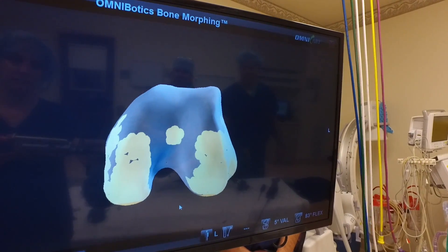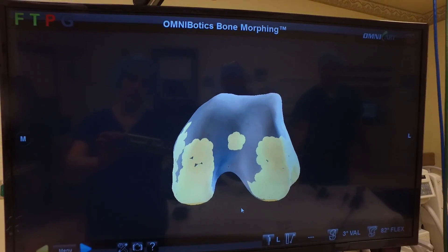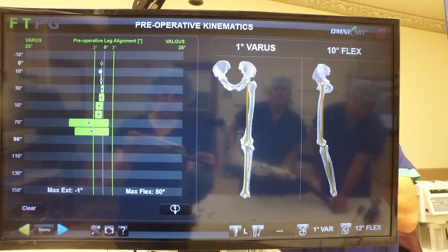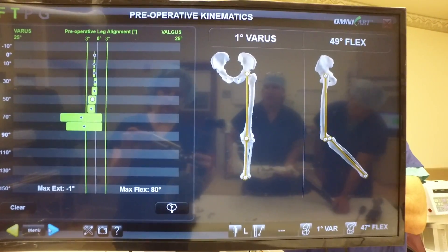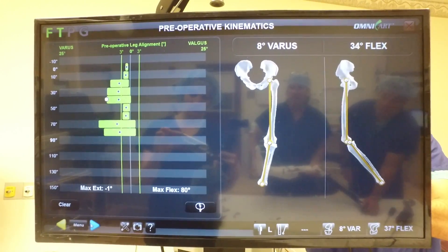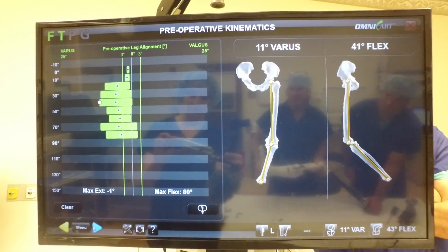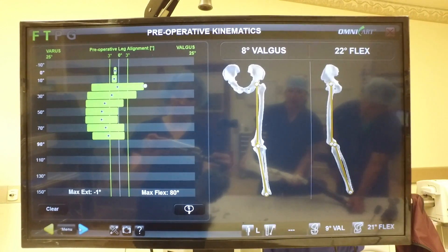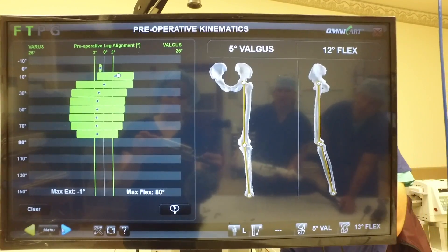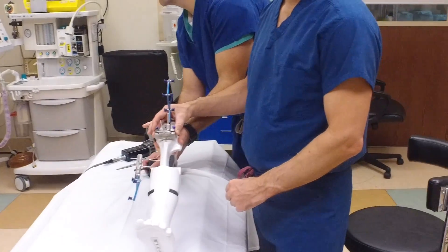The computer marks all those little points of data and records it — that is how it recorded the end of the thigh bone or the femur. As I take the knee through a range of motion, you can see how it's taking the pre-op alignment. Usually we've got a little bit of varus, so it's going to sit like this with a bow-legged appearance. If somebody is knock-kneed, they're going to be the other way. The computer records all that as I take it through motion, giving us the information to decide how we're going to make our cuts.